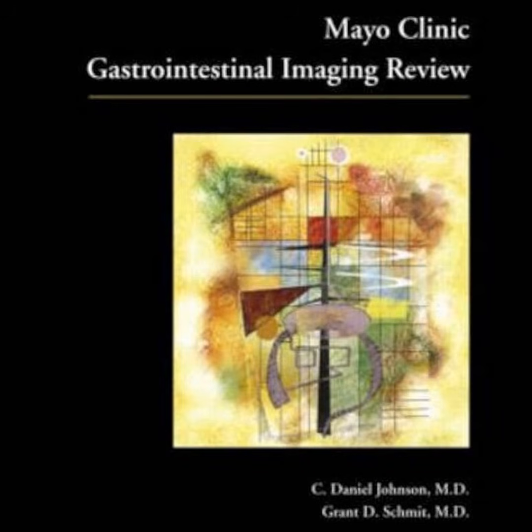Which is terrifying for the patient. So what's the fix? Well, the mechanical fix is just adequate distension. You can administer effervescent granules to generate gas in there, or simply use water or oral contrast. But the positioning is really the key, right? Right. The critical maneuver is patient positioning. Scanning the patient in a prone position or a right posterior oblique position. And that just makes the gas move. Exactly. It ensures that the gas naturally rises to the fundus, fully distending it. And if the mass suddenly disappears, well, it was merely an artifact of incomplete distension. It's just a simple mechanical solution to a really stressful diagnostic problem.